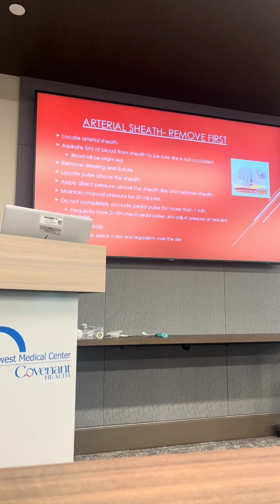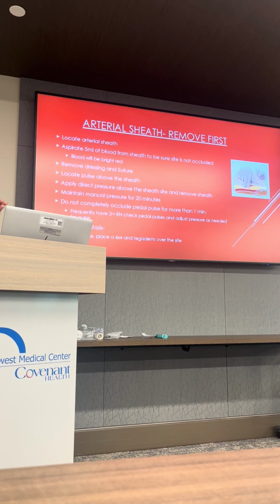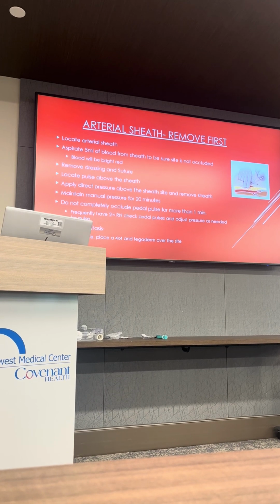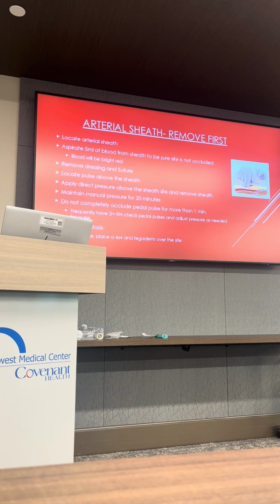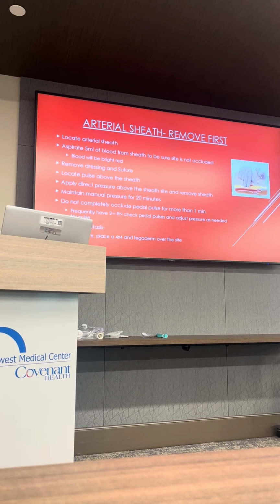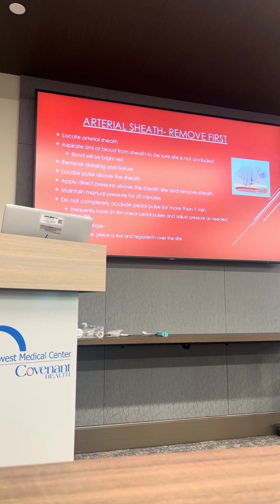Typically about 2 or 3 finger widths is the difference in where we're going to want to hold pressure for these, because you have to think about it, the end of that catheter is essentially where you want to hold the pressure, because that's where the artery would have been punctured. So it does us no good to hold below where the puncture site is. That patient can still have some blood develop.